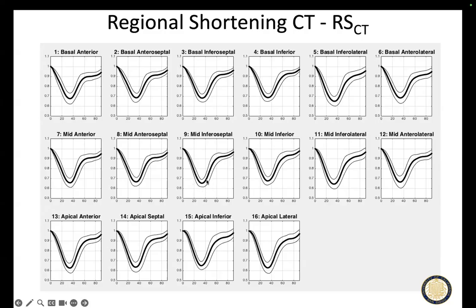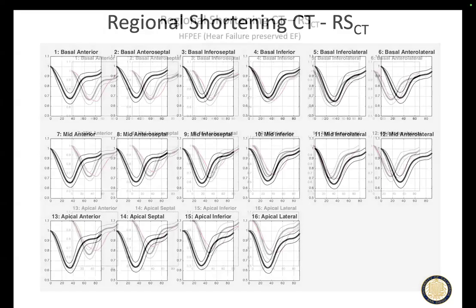So I would need to measure this volume to get ejection fraction, and then I can measure this volume as my end diastolic volume. Right? The smaller or thinner black curves give one standard deviation around the mean.